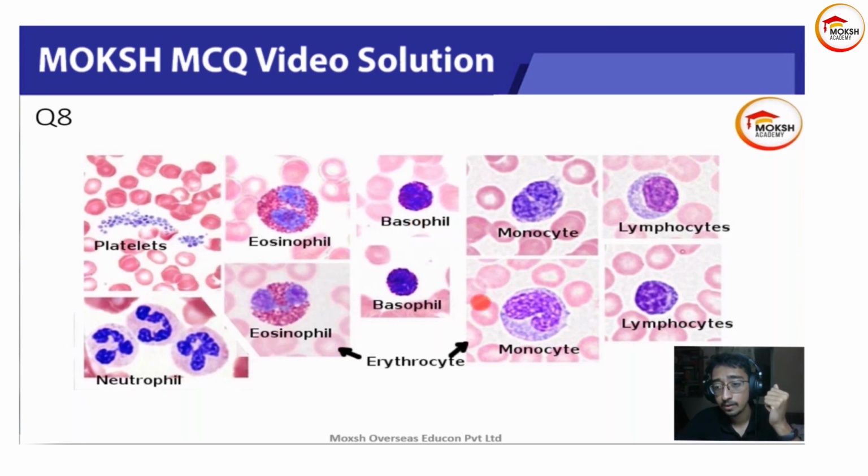Okay. See now, lymphocytes and monocyte. Okay, monocyte, you can see a large nuclei. You can see two nuclei here, a bilobed nuclei here. Yeah, and you have your neutrophils. Okay, so neutrophils kind of stand out in comparison to other blood cells. Right. One second.